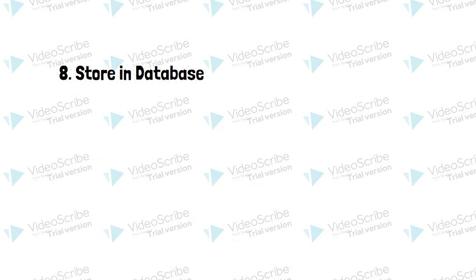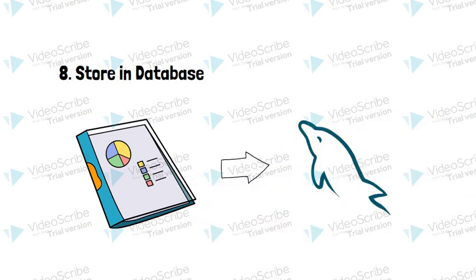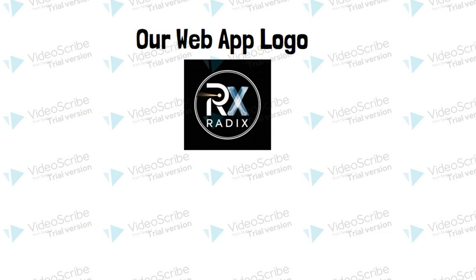Simultaneously, all this information is stored in a MySQL database for future reference and study analysis. In summary, our project streamlines the diagnostic process, providing accurate and quick results to assist radiologists and improve patient care.